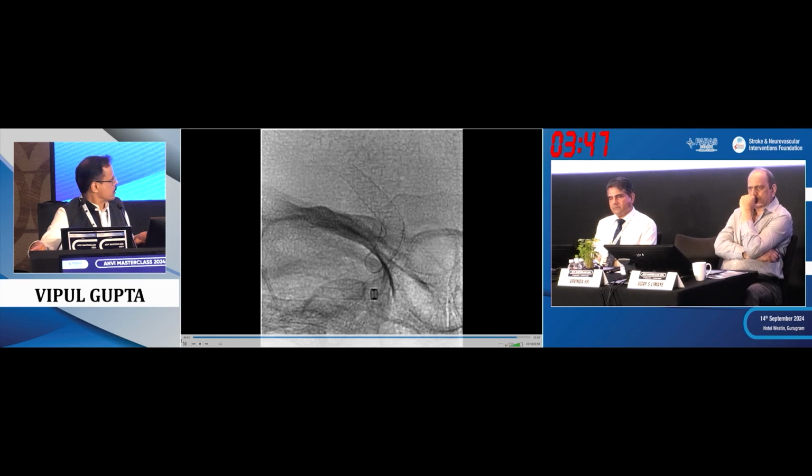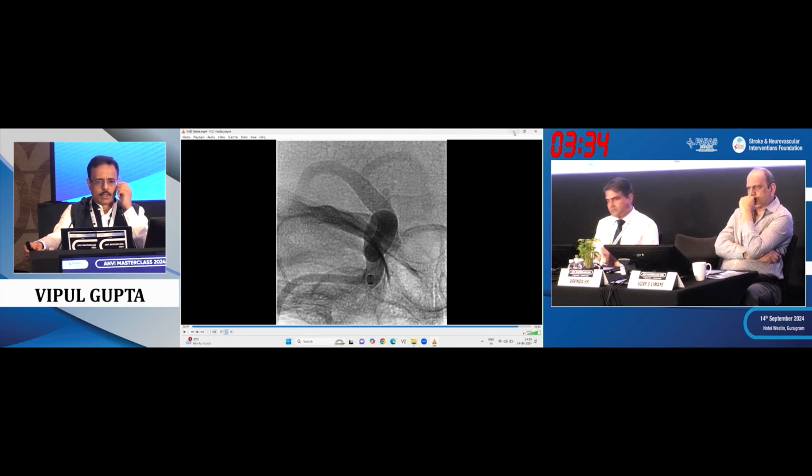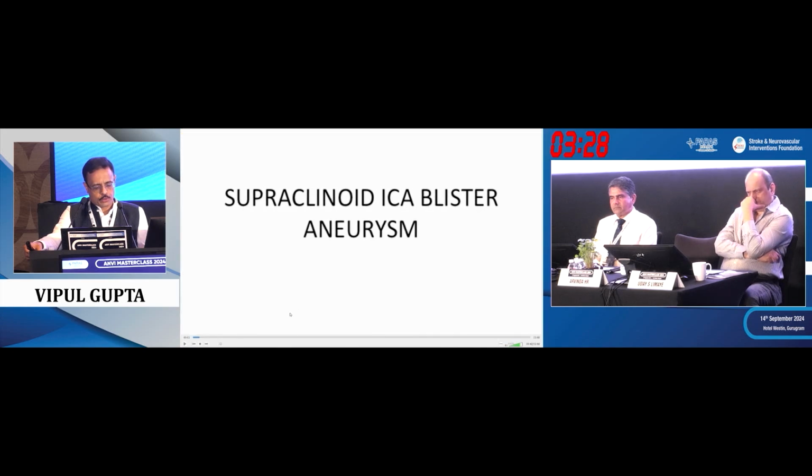And as I mentioned, one flow diverter deployed well usually is a great technique to handle these patients. But to me, what we wanted to show was: plan for a drain beforehand if you have to. Number 2, the antiplatelet regimen should be very, very clear as to what you are going to use.